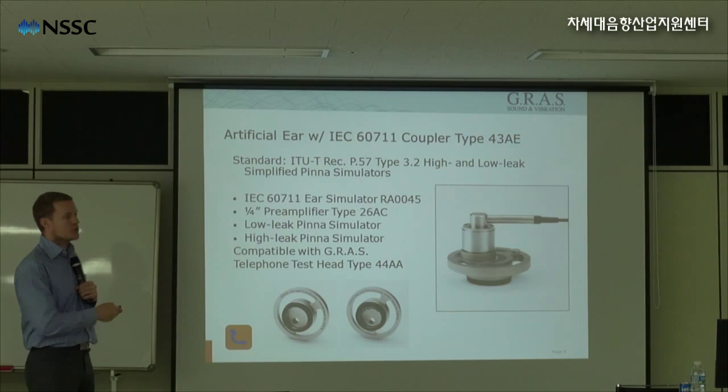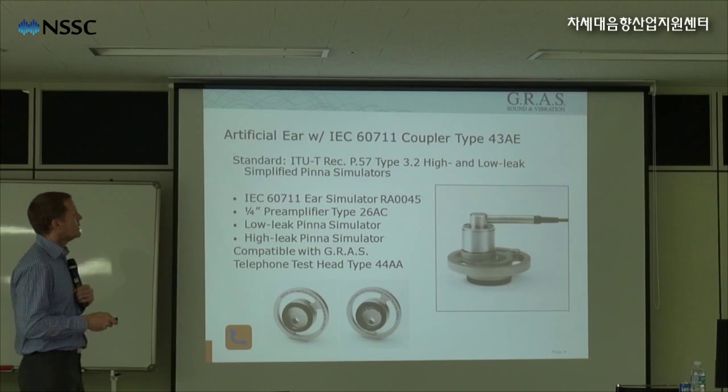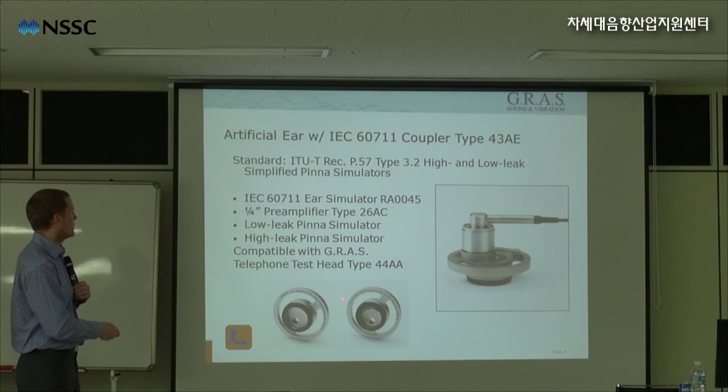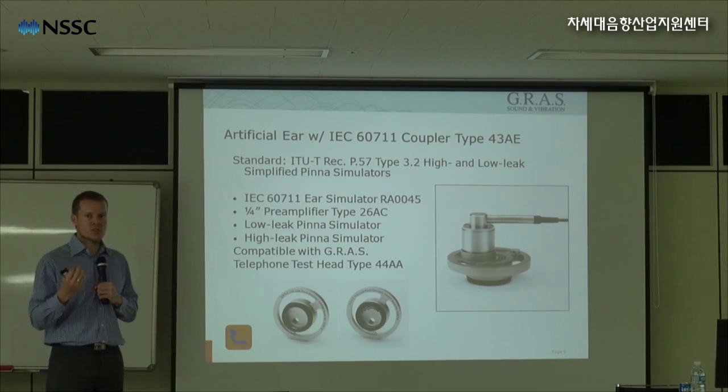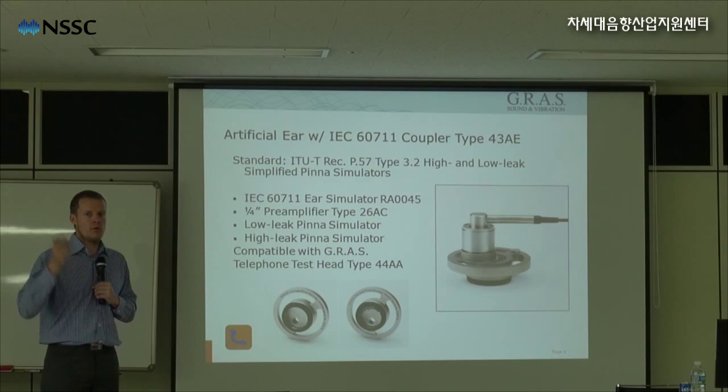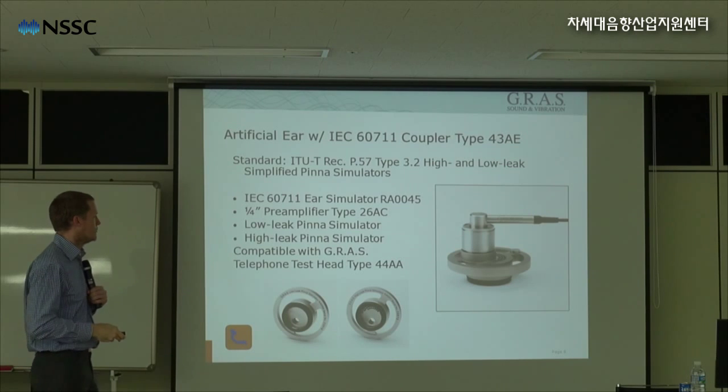The 711 coupler that I showed you just before is, in some applications, linked together with a mechanical pinna, which is solid and representing the ear of a human. So linking the coupler together with the pinna, you will have a full simulation of the ear, the inner ear, and also the pinna, the outside of the ear.